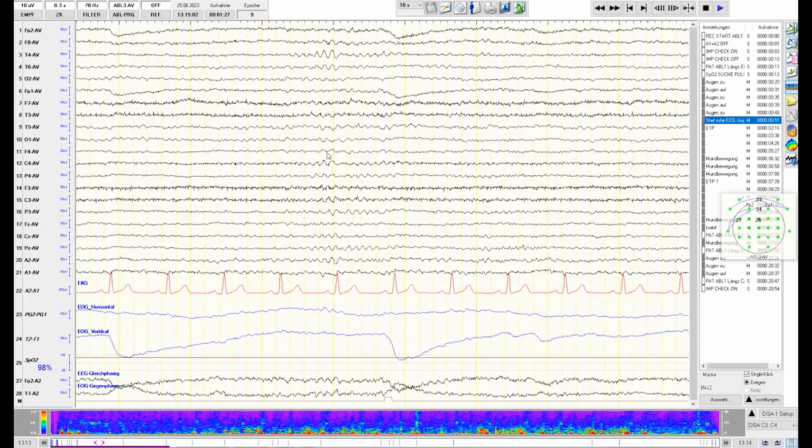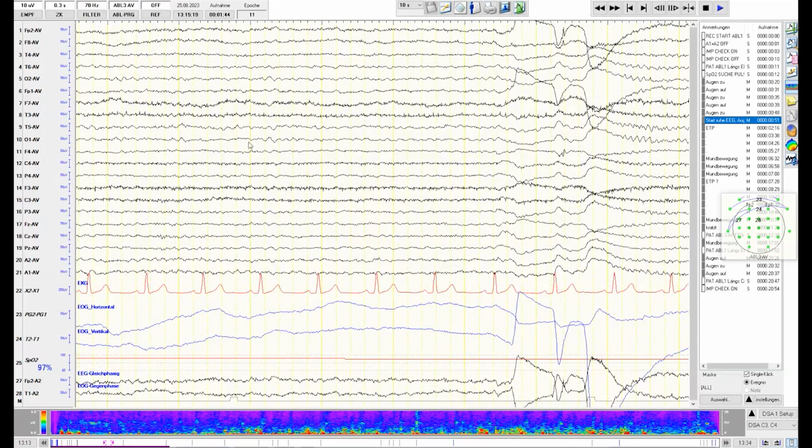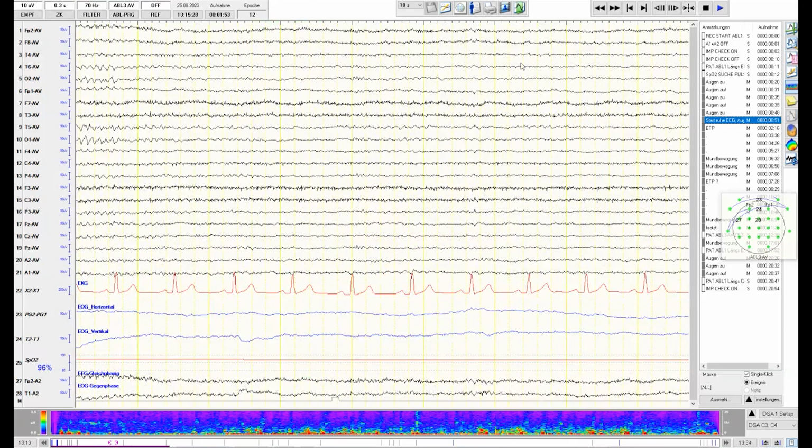And what happens is this patient very easily goes into slower activity. Remember, you have the horizontal eye movements kicking in. So this patient is very, very drowsy. And if we proceed here, we don't have alpha activity anymore, but we have 1, 2, 3, 4, 5, 6, 7, we already get theta activity. So this patient within 1 minute got from very high alertness and alpha activity toward theta activity and drowsiness. We learned from the document that he already took a stimulation medication and still is very drowsy. So it seems that the medication is not sufficient from the electrophysiological point of view.